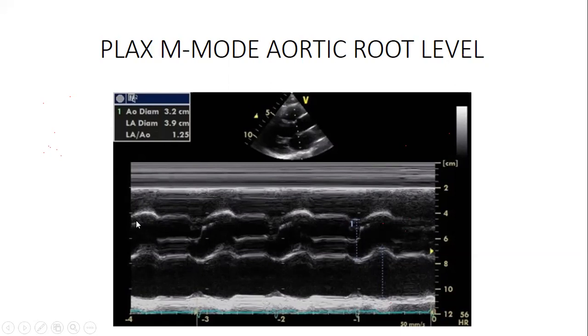And when you look at this aorta, this whole aorta, from here to there, it's going like this, more like it's making a wave. So it's contracting, relaxing. Remember, it's pulsating: contracting, relaxing, contracting, relaxing.